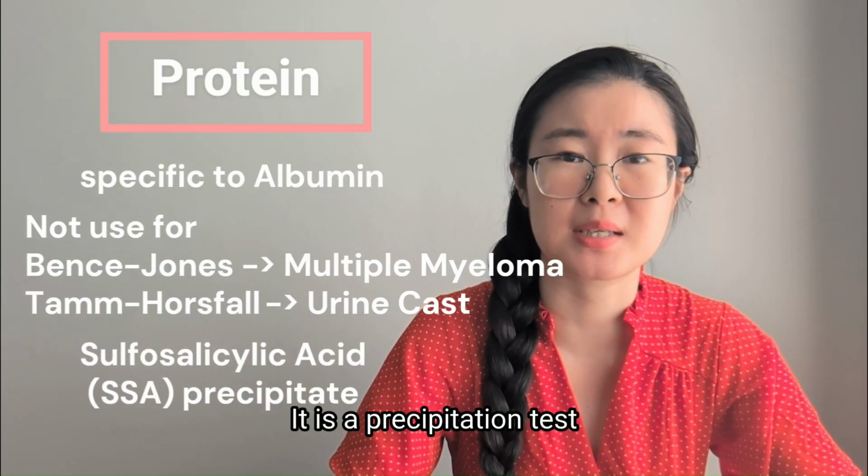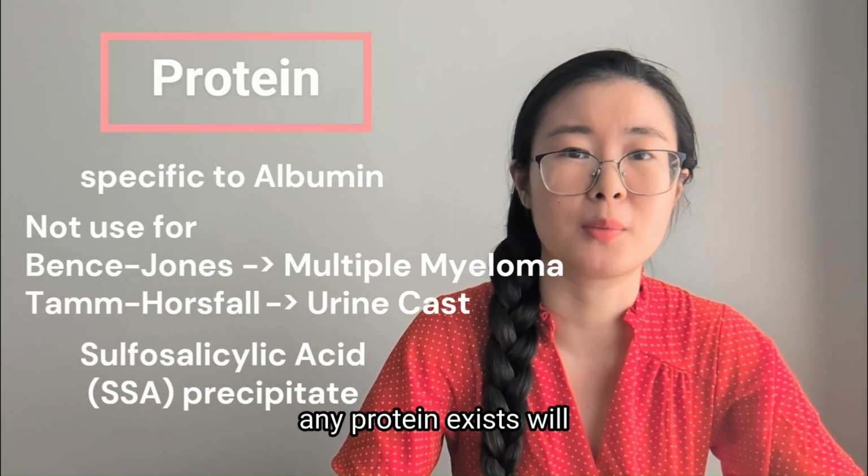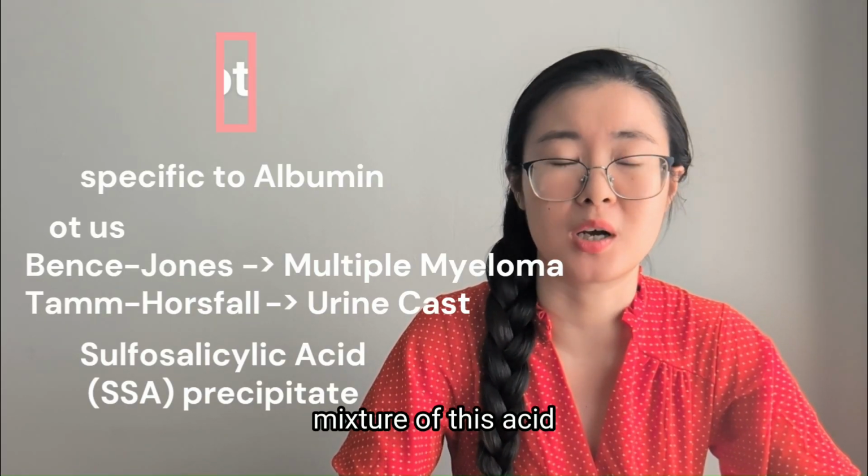And to confirm or detect non-albumin protein, the test you need will be sulfosalicylic acid. It is a precipitation test. Non-specific, any protein that exists will be precipitated with the mixture of this acid.